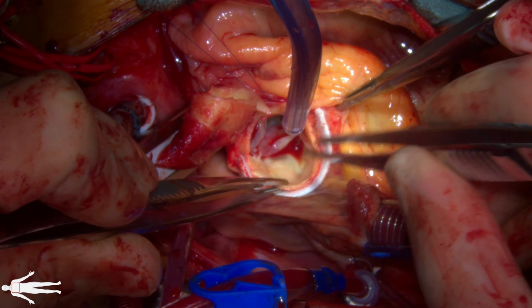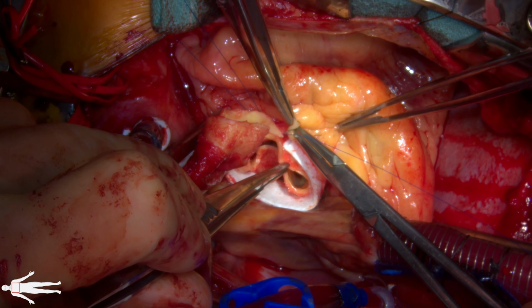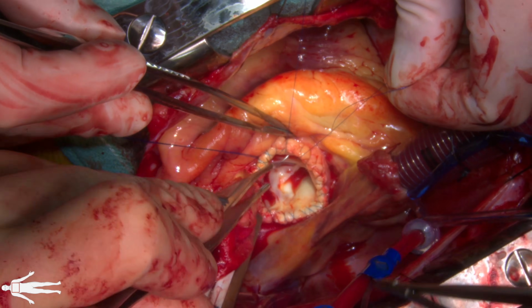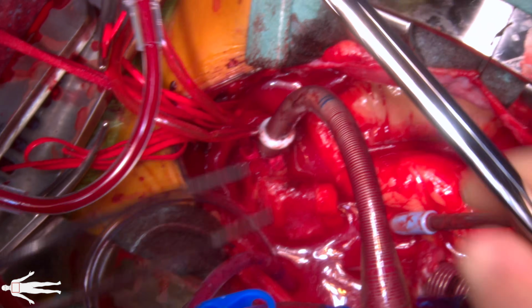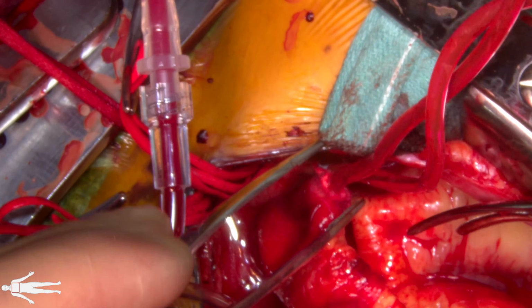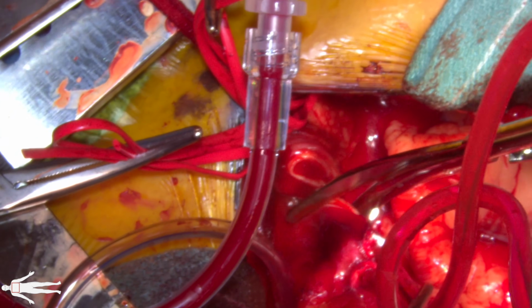A felt patch was then inserted into the dissected sinuses and secured at the sinotubular junction with running 5-0 Prolene in 2 layers. The sinotubular junction was sized and measured at approximately 29 millimeters. After reaching 26 degrees centigrade, the cardiopulmonary bypass circuit was stopped and the cross clamp was released for circulatory arrest.